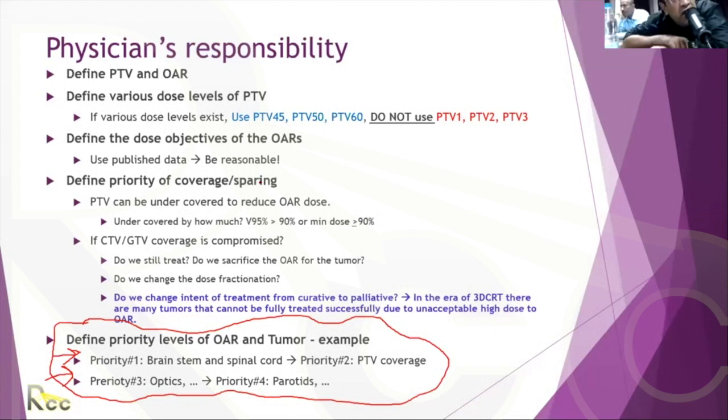If I use PET-CT to evaluate the tumor at the biological level, if the SUV was 3.5, I can't answer this in absolute terms. It has to be individualized for each case. And you are talking about a specific case you have now, but I can't see it. We can discuss if you have a case per se. We can discuss off record, and maybe go through it.